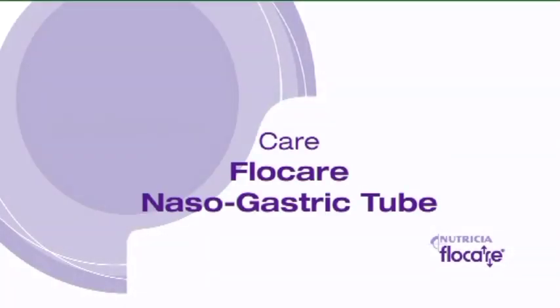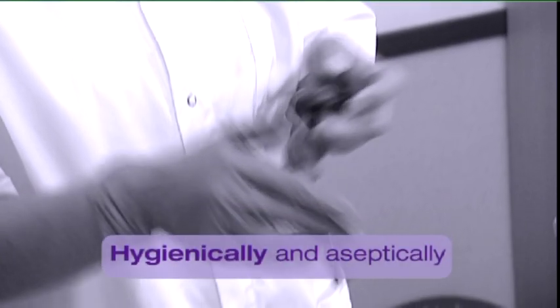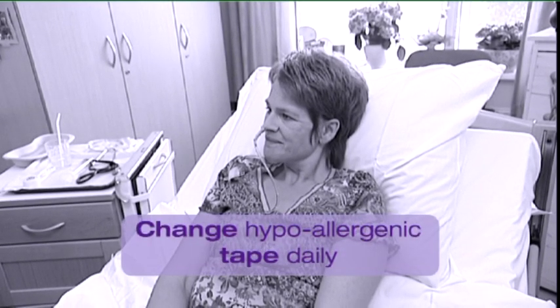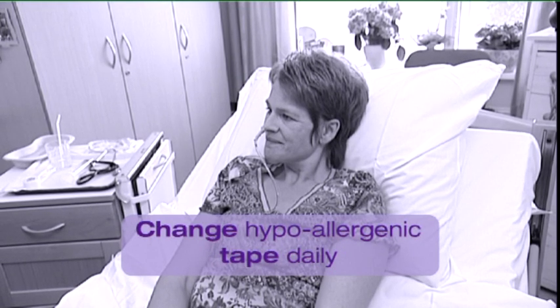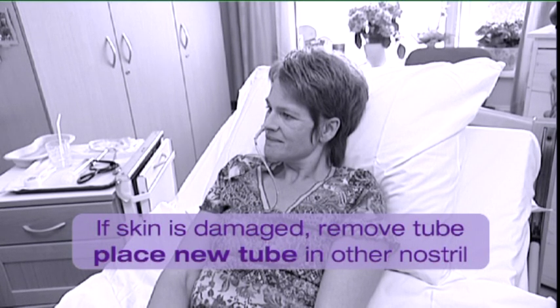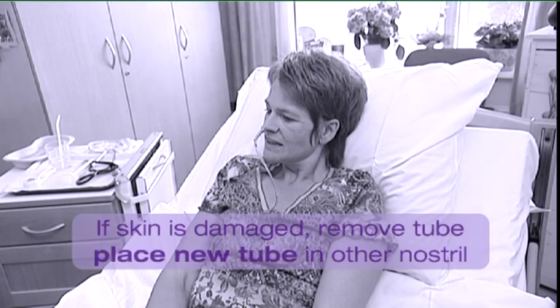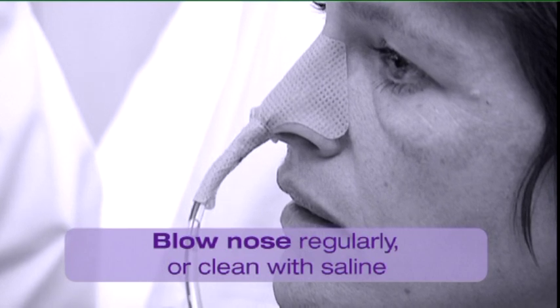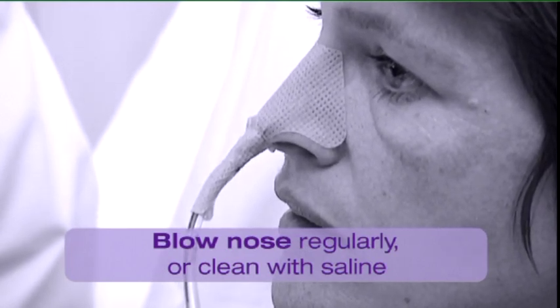Care. Work hygienically and aseptically. Care of the nose and mouth are very important. Change the hypoallergenic tape that fixes the tube daily and clean the skin thoroughly. If the skin under the tape is damaged, remove the tube and place a new tube in the other nostril. Take good care of the damaged skin. Ask the patient to blow their nose on a regular basis; if this is impossible, clean the nose with saline.